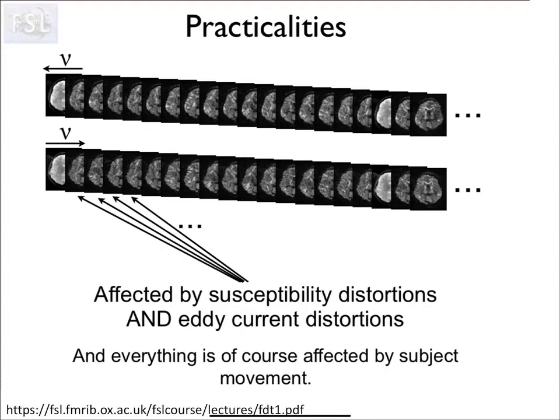Yes. Are there advantages to removing physiological noise with diffusion imaging? That's a good question. I actually don't know the answer. If anyone knows the answer, let me know. But I haven't really seen a lot on that. I mean, certainly for fMRI, it's done quite a lot. For diffusion, I guess motion's a huge problem, and a lot of the other problems are just so much bigger.